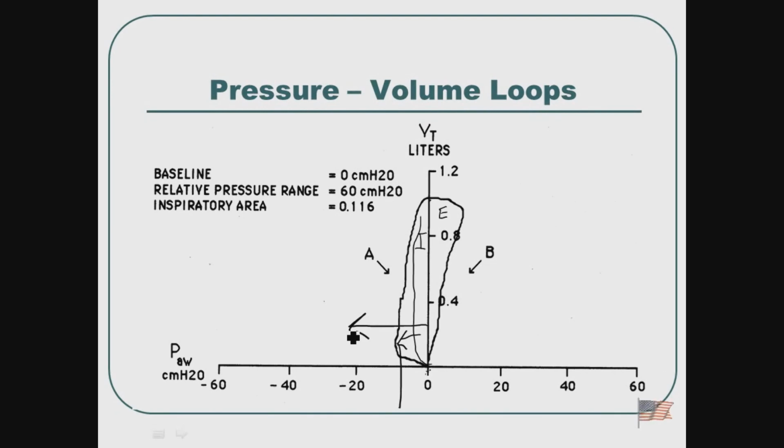Could be, if they were on a mandatory breath, if it took a lot to trigger that breath. Like sensitivity? Yeah, the sensitivity would be off. Could be the sensitivity isn't correct. Yeah, on a spontaneous breath you still have a spontaneous trigger that you have to have to open up the valves. Okay.